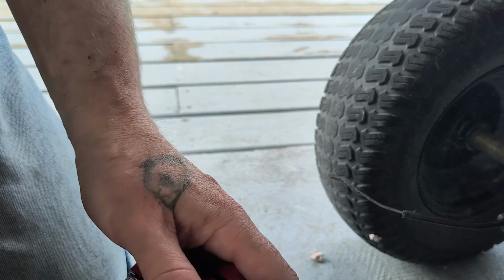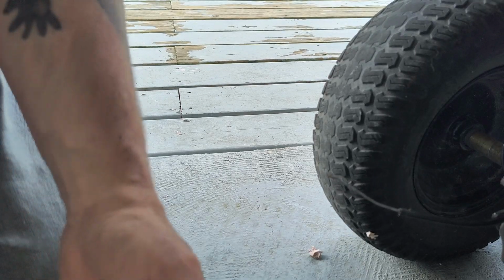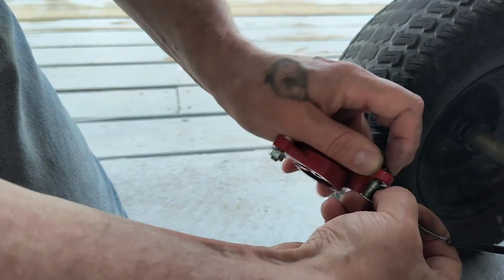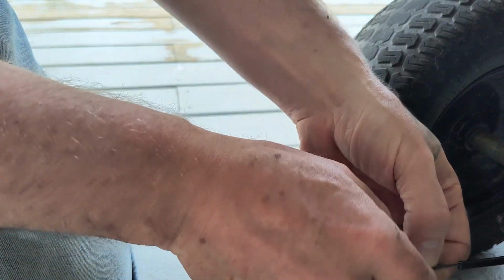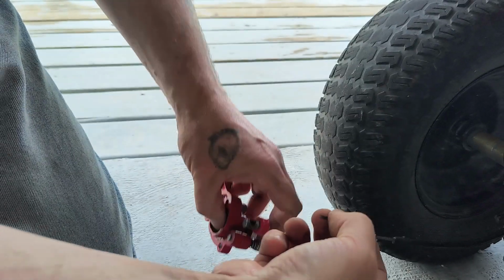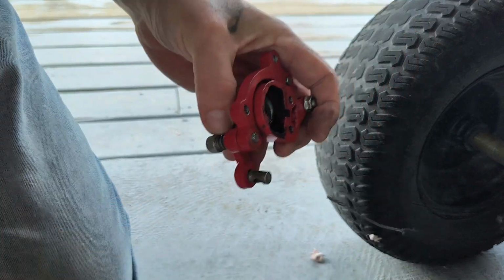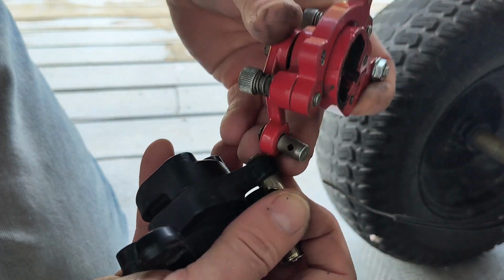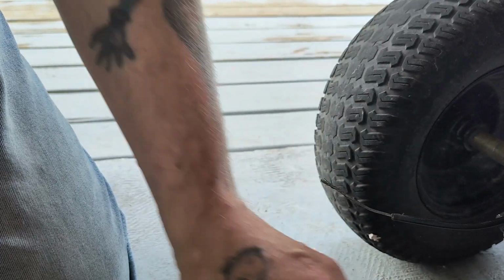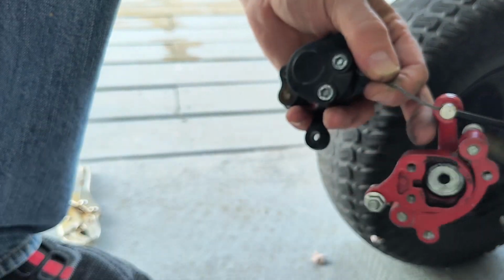That is a thick cable. See if we can get it to fit through these holes. I think that might be the difficulty of this, as compared to this one. A little bit bigger hole in this one. I think we're going to swap these posts. Bring it back when that's done. Okay, got that post swapped out, so cable actually goes in there now.